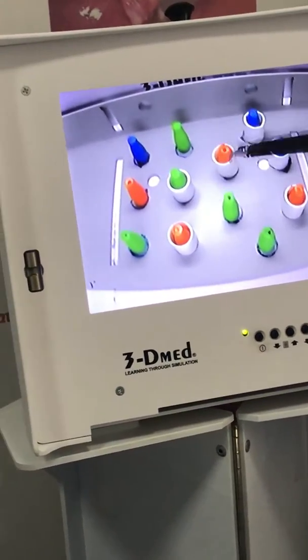Answer for left handed also. It's 12 to 3. No. 9 to 12. 9, 10, 12. With left hand. Yeah. Put this hole.